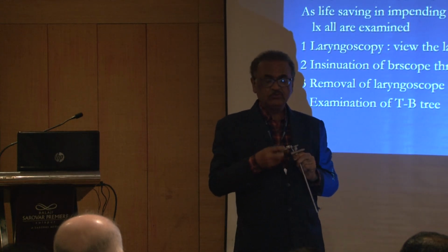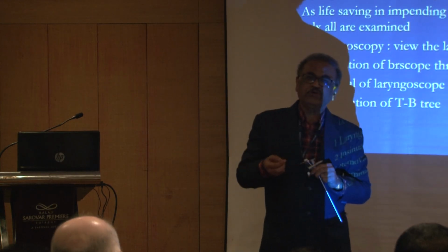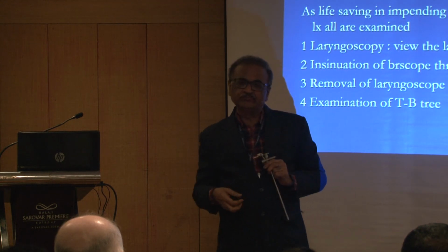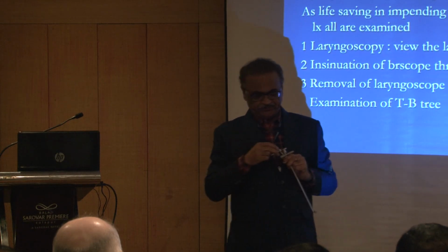So we need to understand this simple principle of venturi, where the atmospheric air is indrawn or sucked in. So along with the oxygen, the atmospheric air is going up.